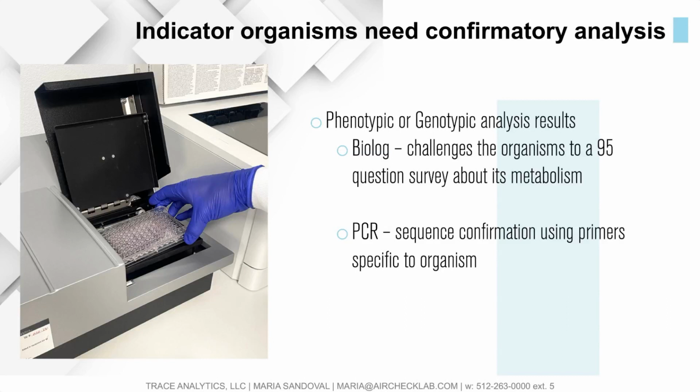And it'll say, based on these 95 questions or challenges, this organism has been deemed E. coli. And we can say with assurance to your customer or to you, hey, we know for assurance you have E. coli in your compressed air.